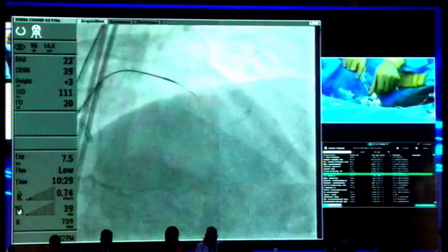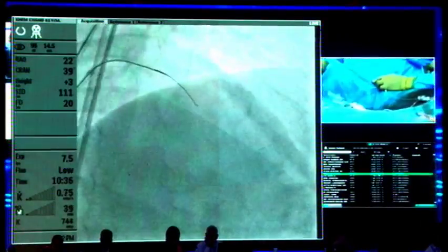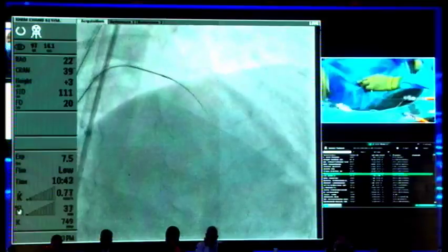We are going slightly down. It requires going down, and then this up is the target, isn't it? See how important the right injection to the distal vessel is. You can see, millimeter by millimeter, which direction to go, because this is not that safe a wire.